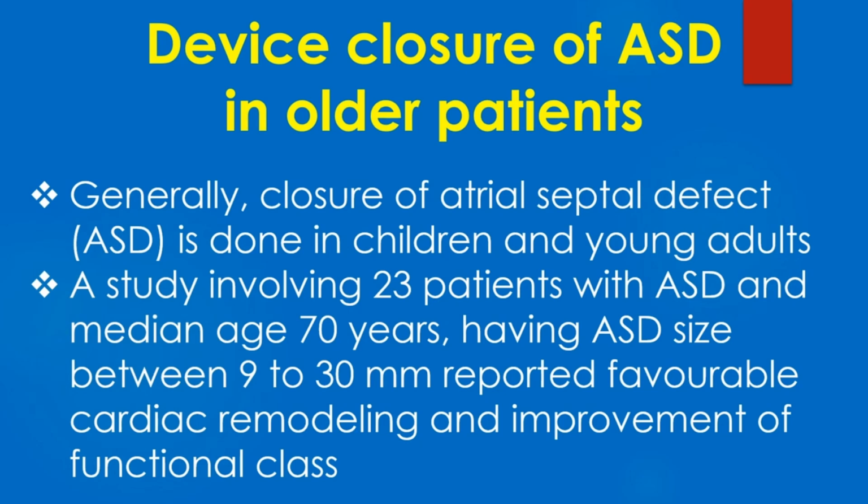Generally, closure of ASD is done in children and young adults. A study involving 23 patients with ASD and median age of 70 years, having ASD size between 9 to 30 mm, reported favorable cardiac remodeling and improvement of functional status.